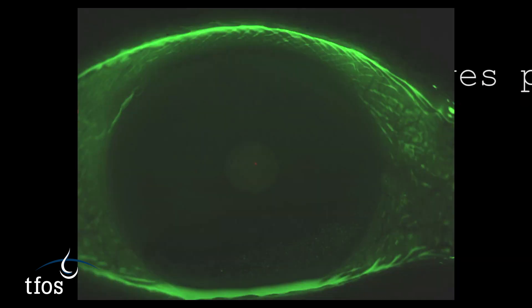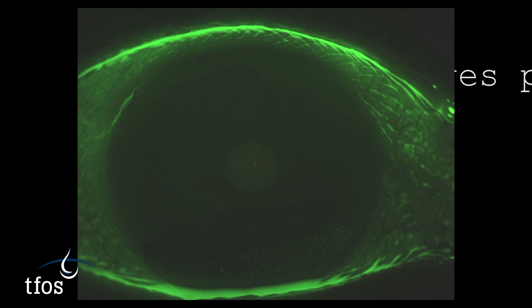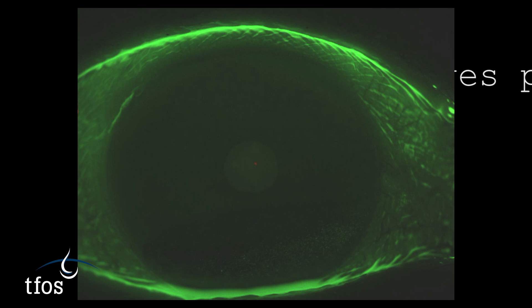For a diagnosis of dry eye, a positive result is greater than five corneal punctate spots. Validated grading systems can be used to monitor changes in the severity of staining over time.